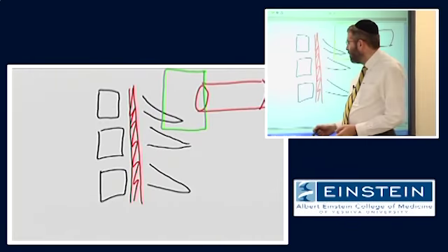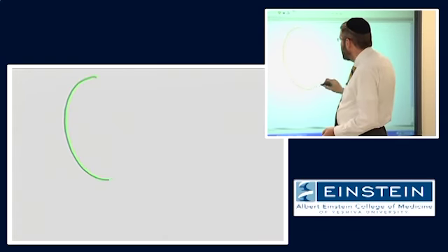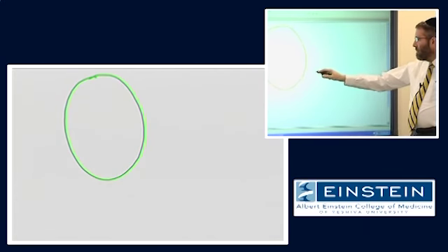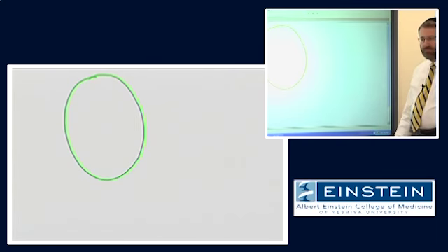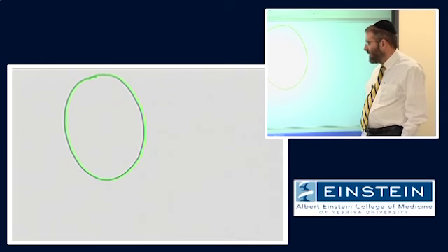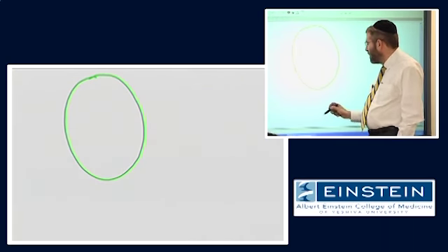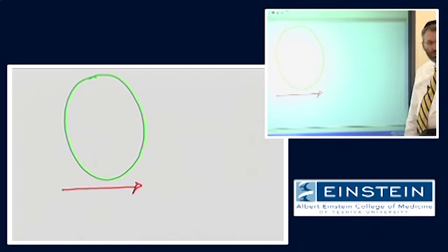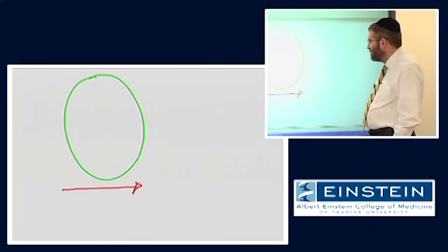All right, so what we've talked about until now is taking our image, let's say we have an image of the brain, and making this image sensitive to diffusion in any direction. If, on the other hand, we generate an image where we are sensitive to diffusion only along a single direction, what will that image look like?